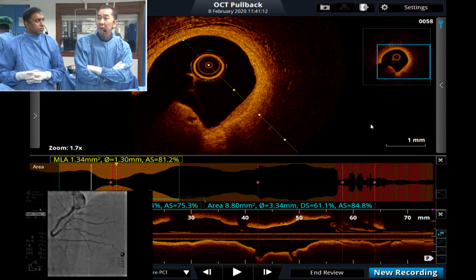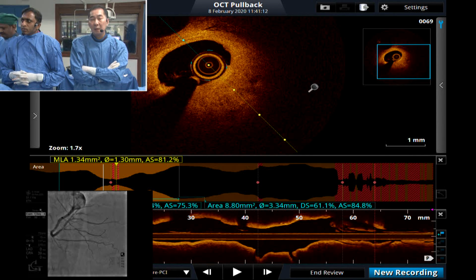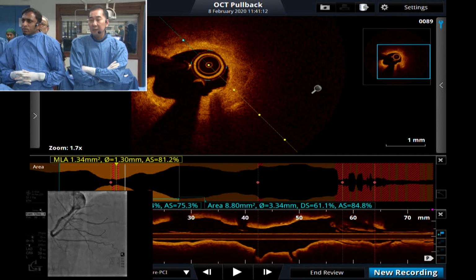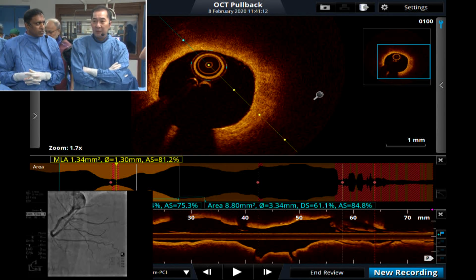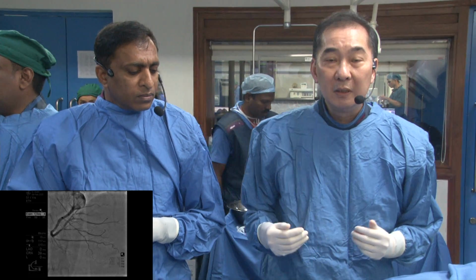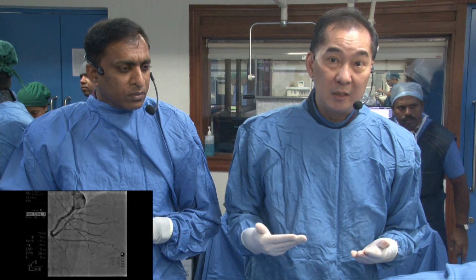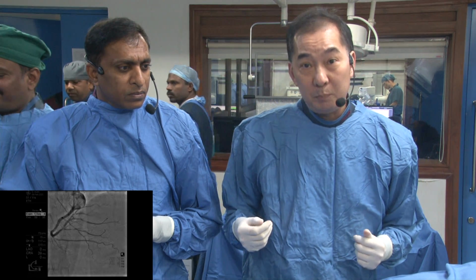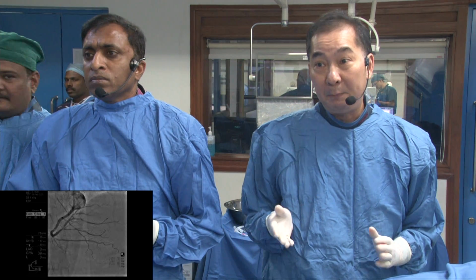Provisional. Tak, with the consideration from the OCT that there is a chance of this side branch occlusion, would you consider prepping that lesion that you have not prepped yet? Actually, I am still against the idea of prepping the lesion at the beginning because I am afraid I will convert this side branch from a one-stent technique to a two-stent technique. That's what I'm afraid of. In this case, I think I will use the jailed balloon technique, which may be a better approach rather than just putting a bare wire in.